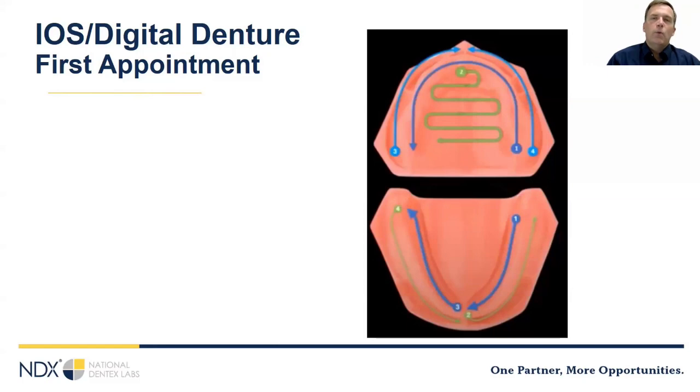So that's if you want to start analog and flip to digital. What if you want to start digital and keep going digital? One of the advantages of the latest generation of iOS systems is that they allow the possibility of taking an accurate and fairly rapid edentulous scan. Sometimes this can be difficult to do clinically, so you kind of have to decide what works in your practice.